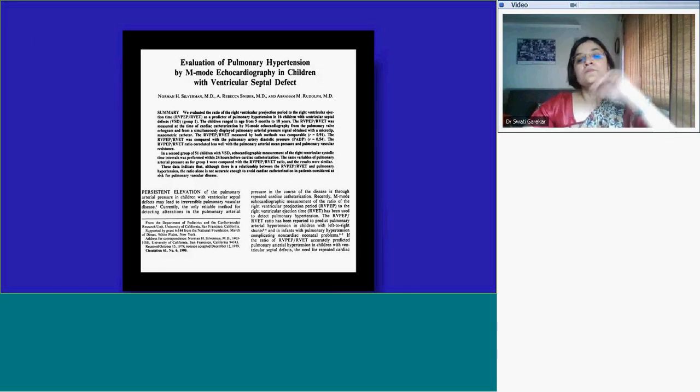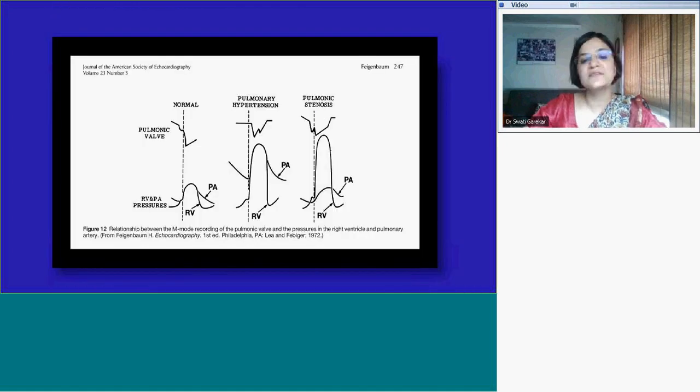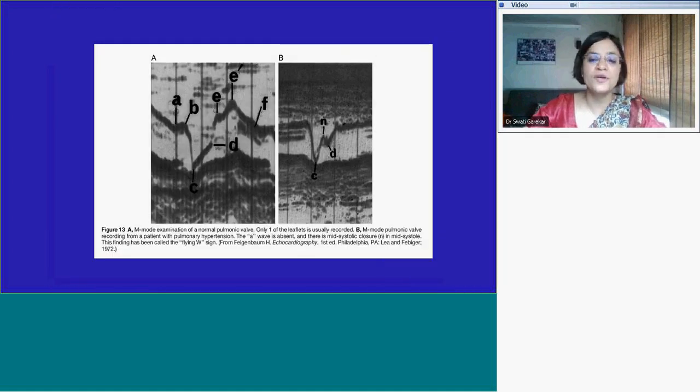Okay, now we actually have no time. I'm going to skip pulmonary hypertension and M mode evaluation. I'm sorry, I don't do it. I did find literature about it. It seems to me there's enough data which says that it's not reliable. There are better ways, and I'm sure some will be covering PH evaluation in echocardiography for you.